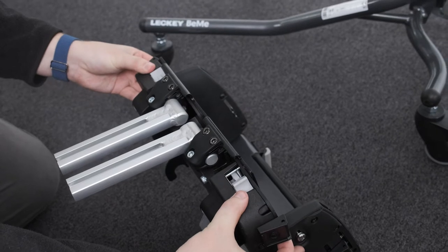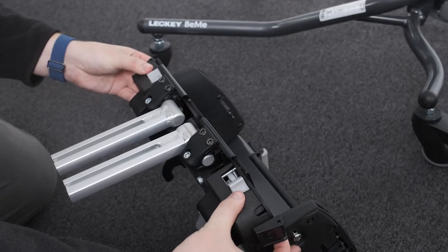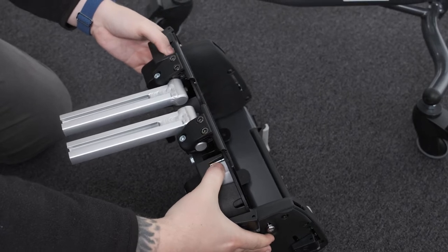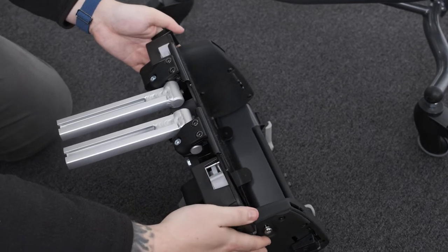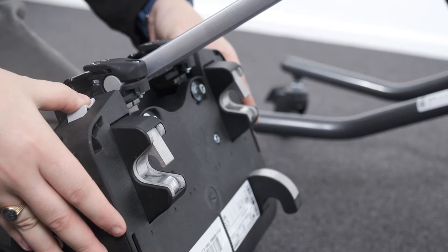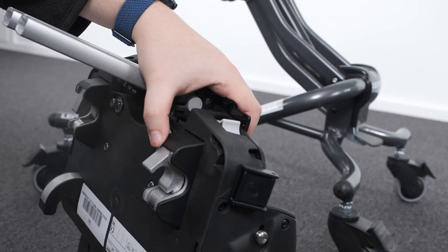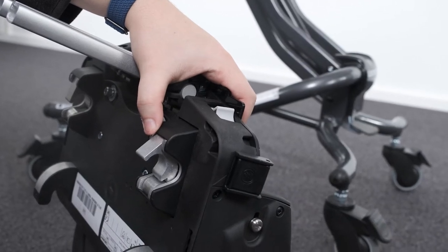Attaching and detaching the seating unit to the chassis. Before attaching the seat base, ensure the locking latch at the front is released. If the locking latch is locked, locate the right and left grey locking latch release buttons at the front of the seat. Simultaneously rotate the buttons towards the centre of the seat and then press inwards. An audible click will be heard when the latch is released.